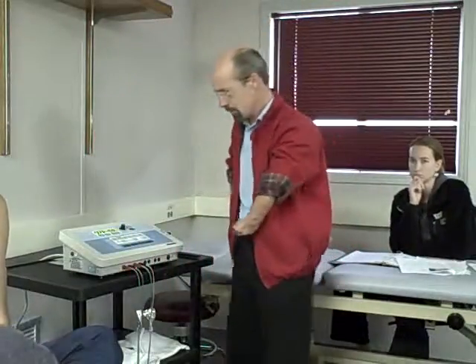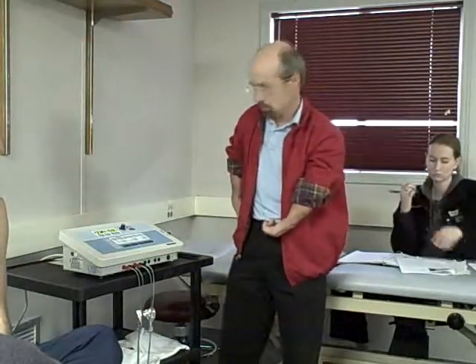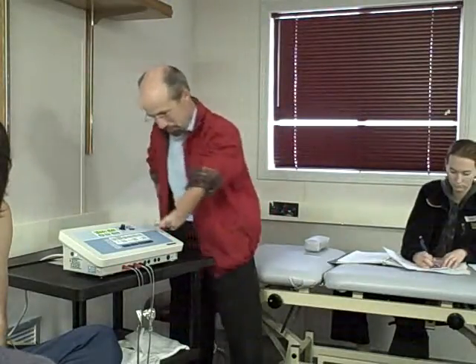Okay? So pretty straightforward again. Hit the waveform, hit intensity, and press start. Remember, start is just starting the clock. Just remember that. Start is starting the clock. Set the timer, walk away.